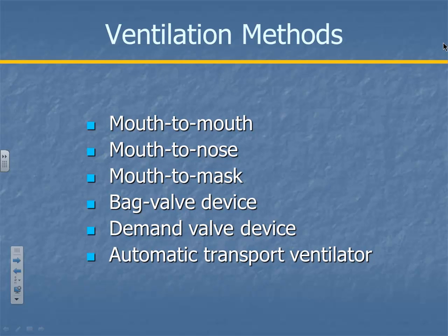But you can feel the compliance in the patient. As you're filling their lungs with air, you feel that compliance. As it gets harder to blow, then their lungs are full. So from that standpoint, it's very handy. Bag valve mask is going to be the way we're going to do it in the field if we have to ventilate a patient, right?